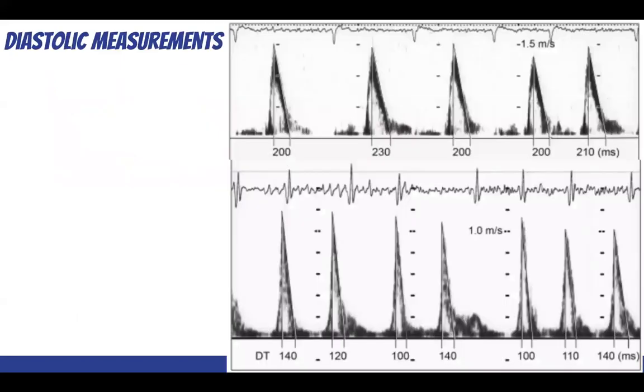All right, so obviously a lot of these patients will have AFib. For AFib, a few things will not fit the usual criteria that we use. Number one, there's no A wave, because the A wave comes from the atrial kick, and in AFib the atrial kick is gone. Another thing is that the E waves are not as regular as you want them to be, and they also depend on the cycle length and where they end.